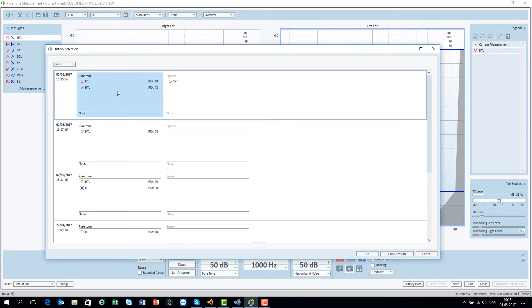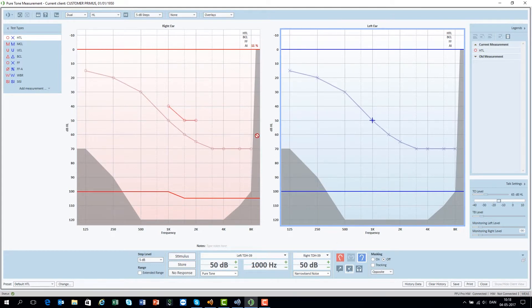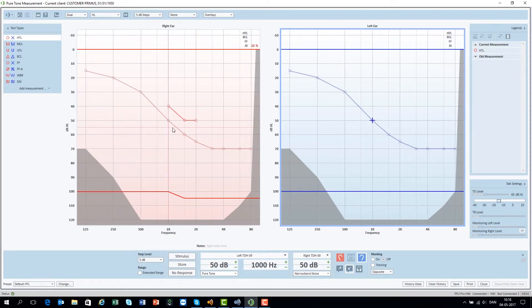You simply click on historical data and select the needed session and click OK. The old measurement data will now appear as a slightly shaded line, making it easy to see the difference between the new and the old data.